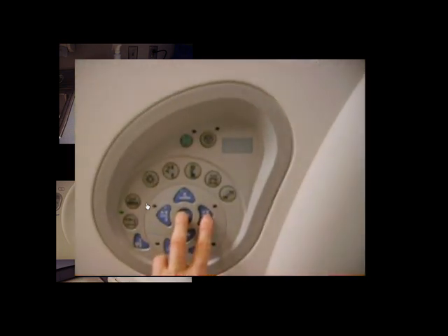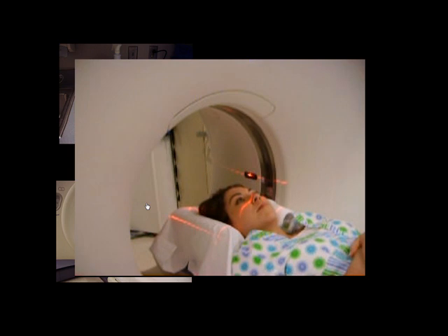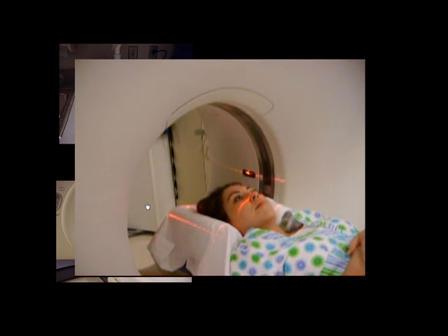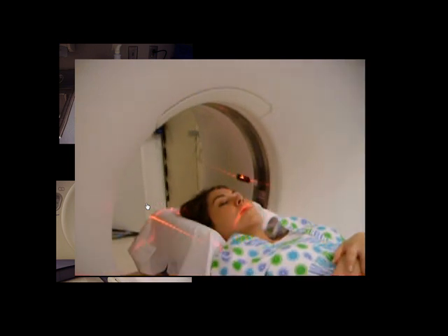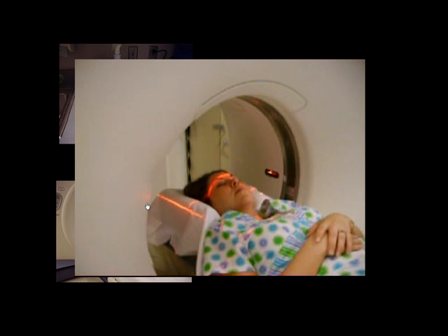And this is moving the patient in. We'll press on those two buttons. Like I said, we'll go over that a little slower later on. You can see the patient moving in. I've turned the light on. And we want the patient positioned so that you can use the outside or inside light. I'm using the inside light.